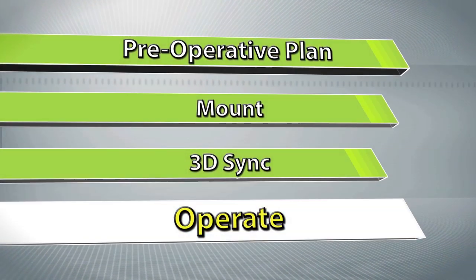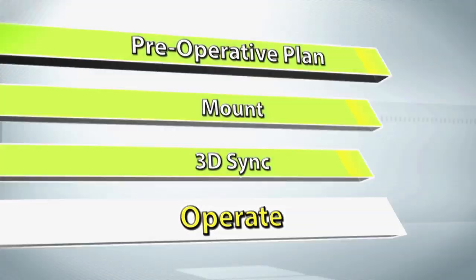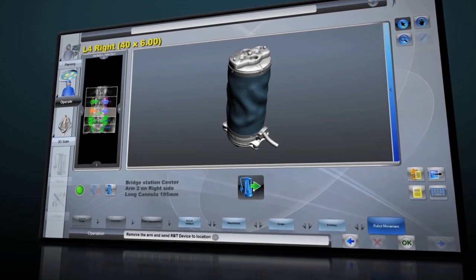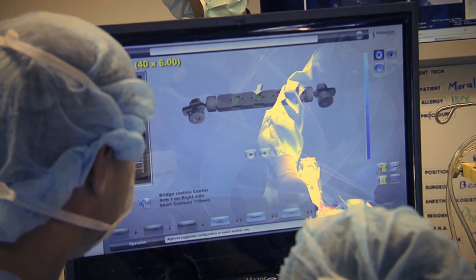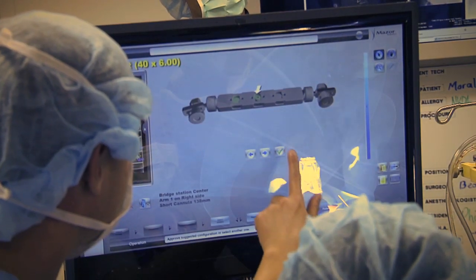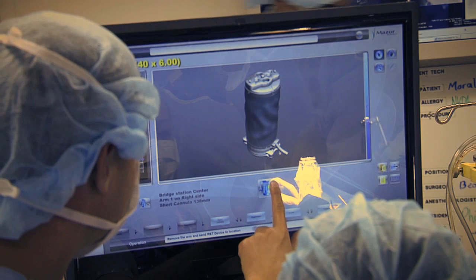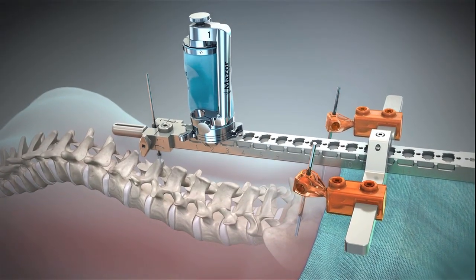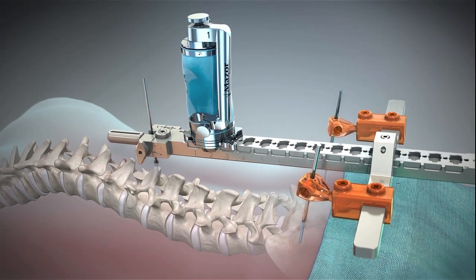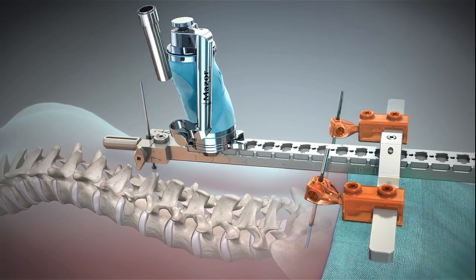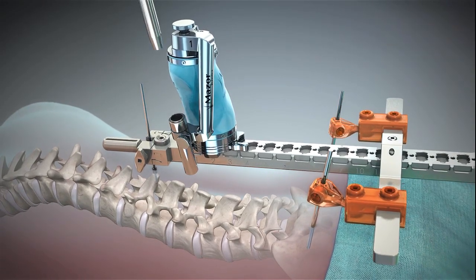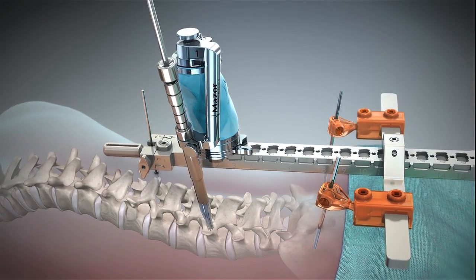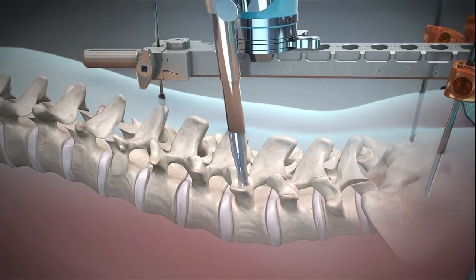Once 3D sync is complete, the surgeon is ready to operate. To begin the surgical procedure, select a target vertebra from the plan. The software will display precise instructions of where to attach the guidance unit on the mounting platform. Once attached, the guidance unit is sent to the preplanned trajectory, allowing the surgeon to instrument with 1.5 mm accuracy for both open and percutaneous procedures.